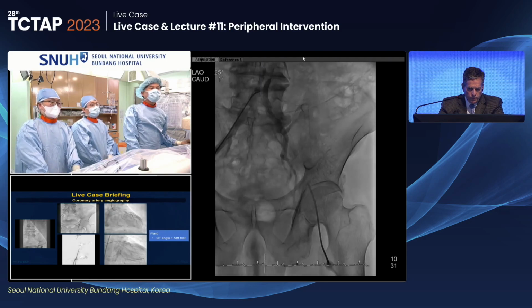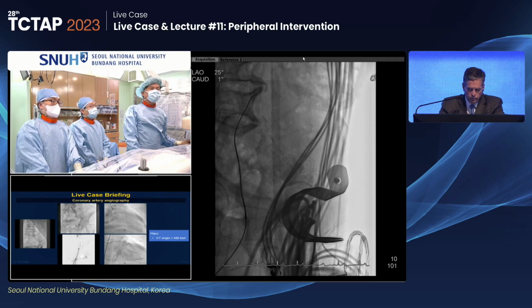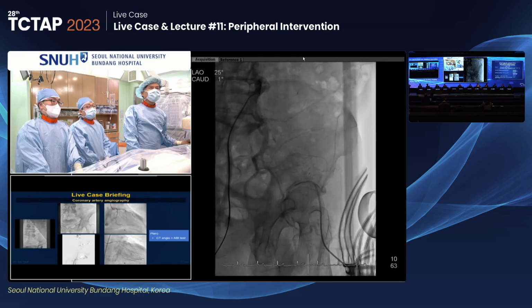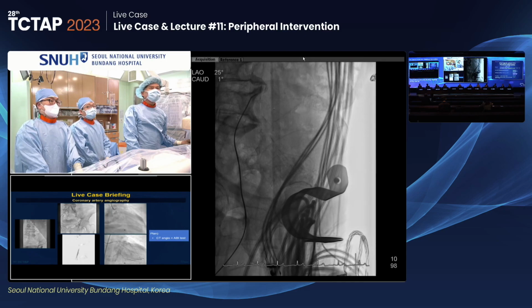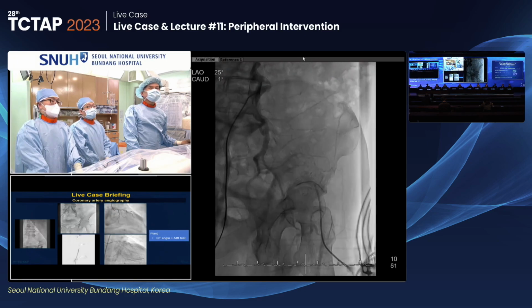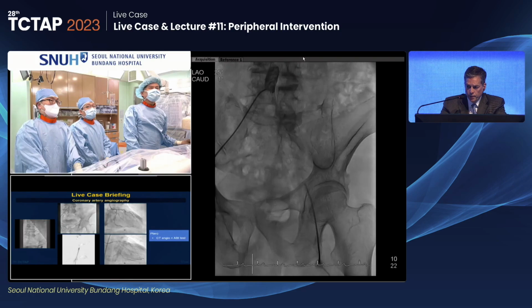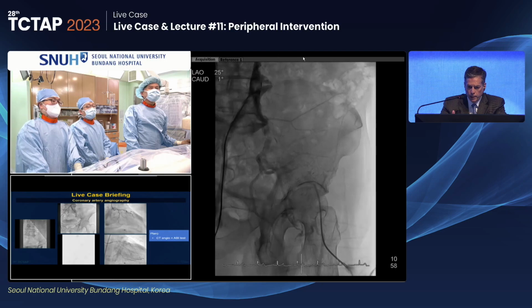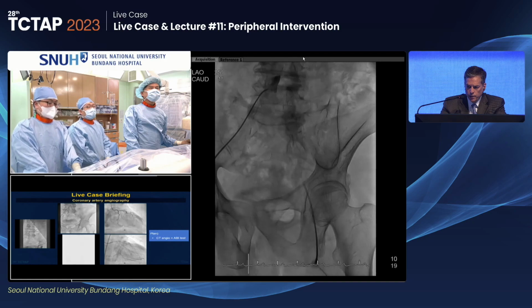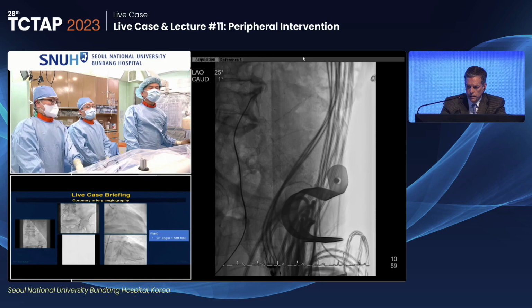How about your wiring preference for this iliac total occlusion, the 18-wire system or the 14-CTO system? I think it's dealer's choice at this point. I'm still kind of old school. I'd still even probe it with an 035, see if it follows a channel. Many of my colleagues go immediately to an 014 and a jacketed wire at that, or an 018 jacketed wire.